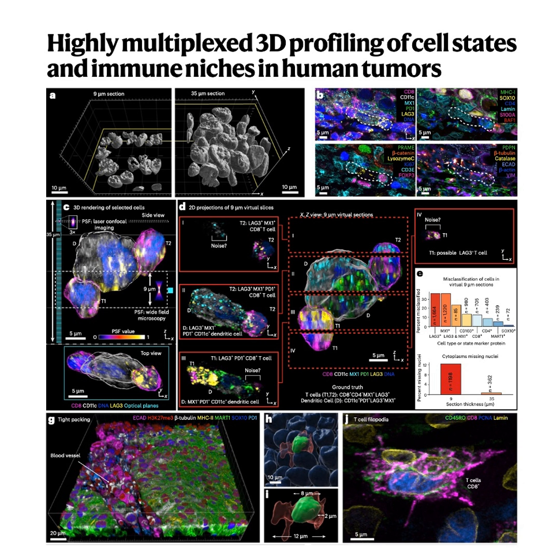Okay, this is really powerful. Let's do another quick recap here. We've seen that 3D CyCIF moves beyond just fixing the fragmentation issue. It reveals the true, dense architecture of the tumor microenvironment. Right. And it crucially visualizes the previously hidden network of cellular extensions, filopodia, dendrites, essential for communication and probing. It corrects misinterpretations about cell shape that arose purely from the limited 2D perspective, and it allows us to capture dynamic events like cells migrating across vessel walls. And finally, it brings subcellular detail, visualizing organelles and the functional localization of proteins like LAG3 and granzyme B, even in archived human tissues, revealing not just presence, but functional state.